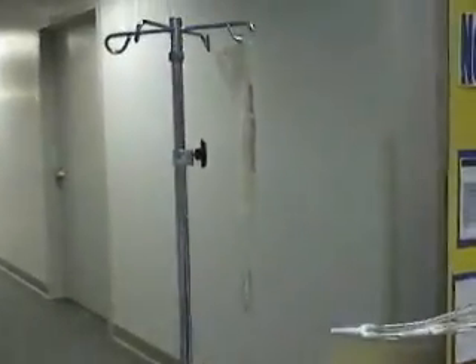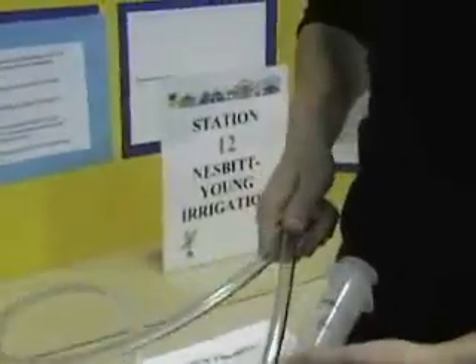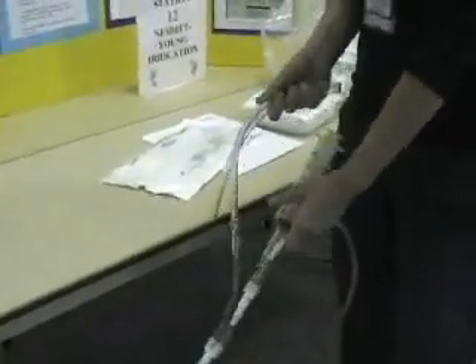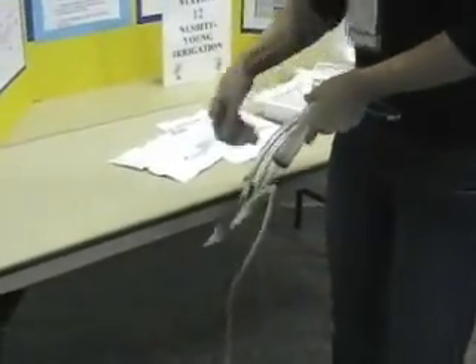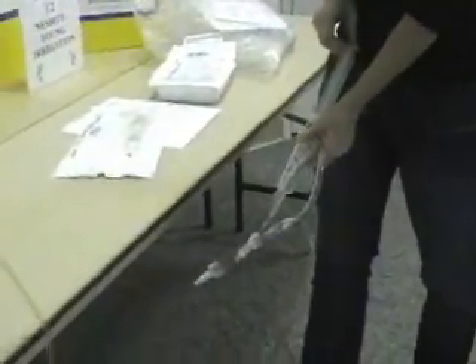So what you're first going to do to actually irrigate the bladder — you want to clamp the Foley catheter drainage bag nice and tight so it doesn't leak anything. This is going to be down to the floor. You want to use your dominant hand to actually pump the bladder, so keep the clamp in your non-dominant hand. Then what you're going to do is open up the irrigation and draw usually 100 to 150 cc of normal saline — you pull on the syringe like this. That's pulling the saline into the syringe.